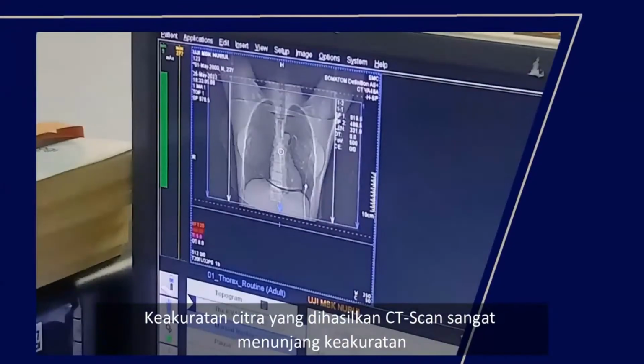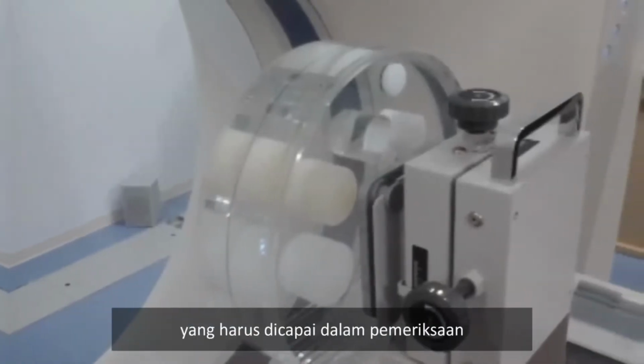supporting accurate diagnosis. Image quality is a vital aspect that must be achieved in CT examinations.